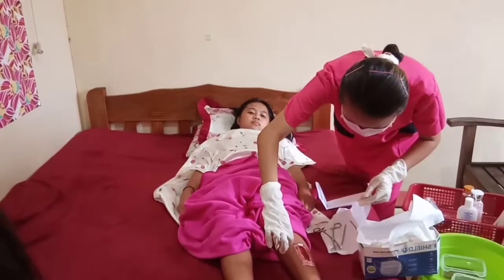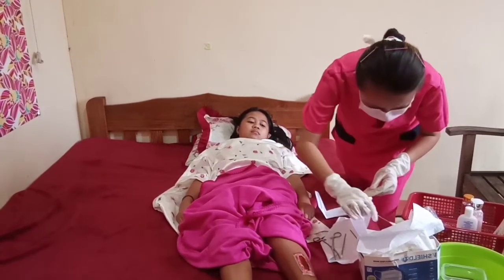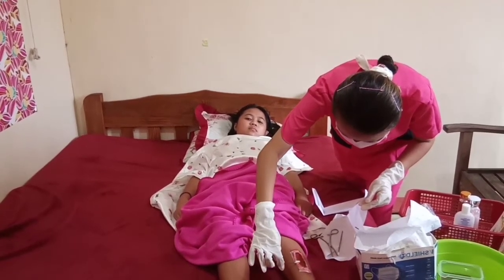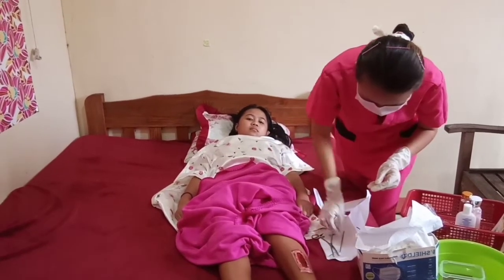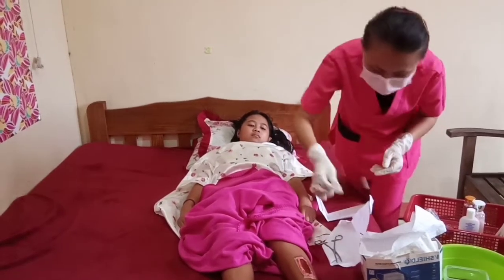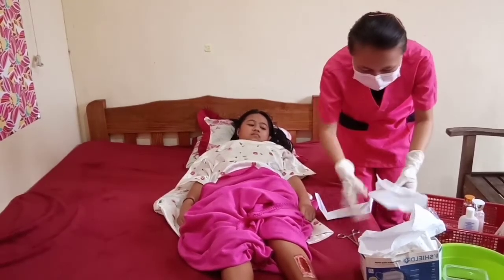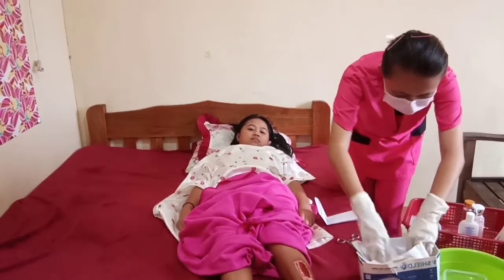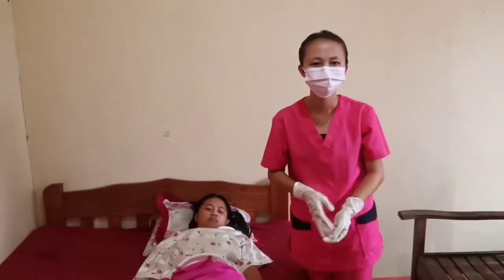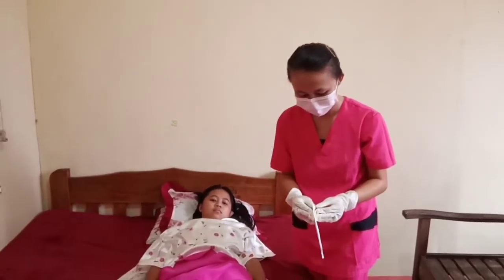So one stroke. To the most contaminated area, which is the sides of the wound. And then after that, and now use dry gauze to swab in same manner. I have here the sterile gauze.